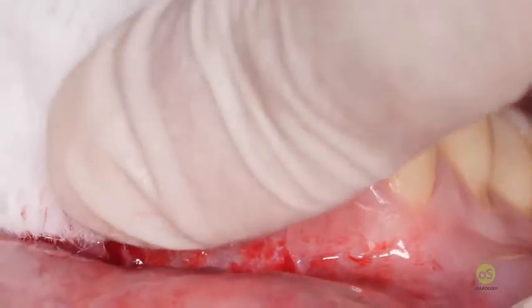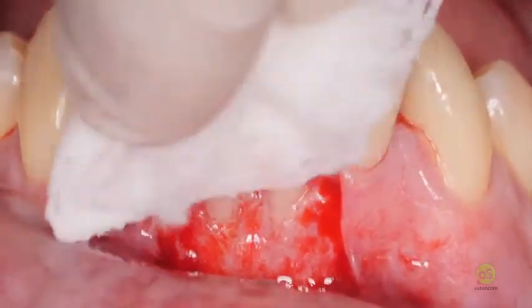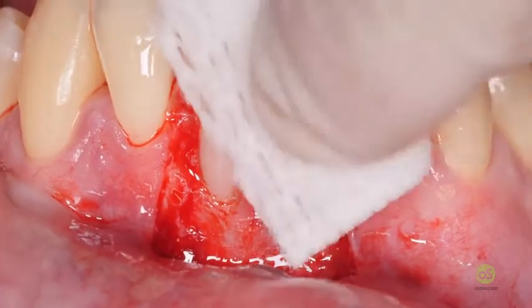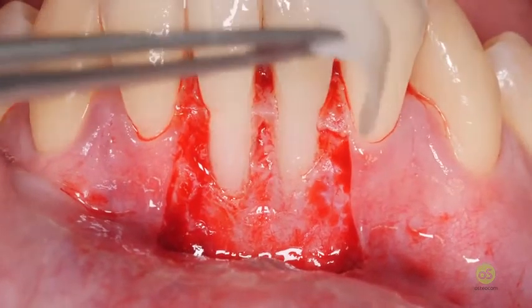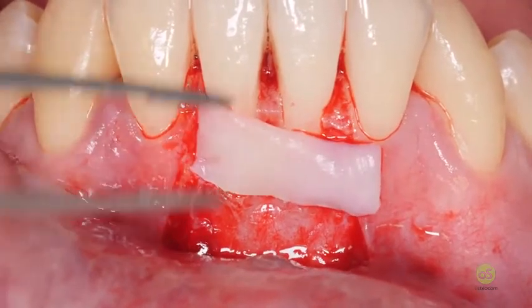Now also in the way that the assistant has to keep your lip, you shouldn't pull too much because you have a good control of the bleeding and you don't want to stimulate bleeding coming from the pedicle. Now it's the time for the connective tissue graft application.